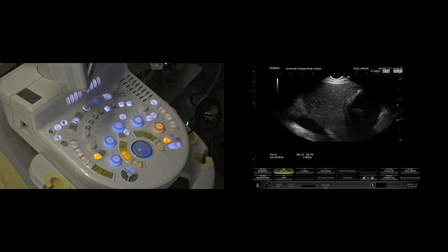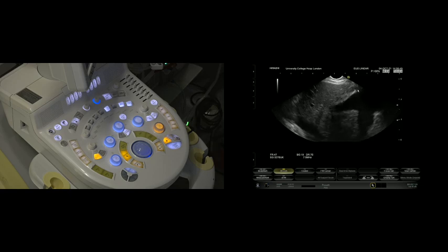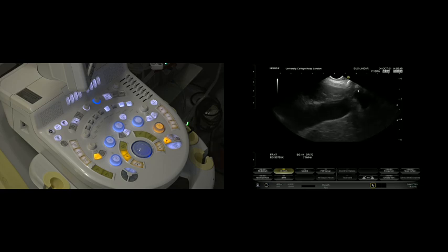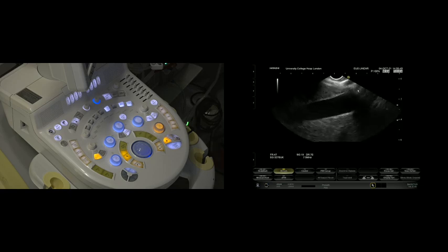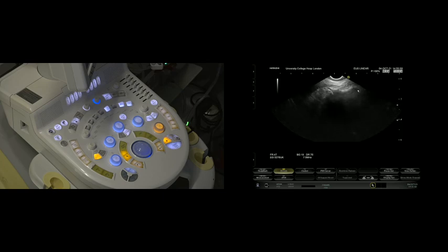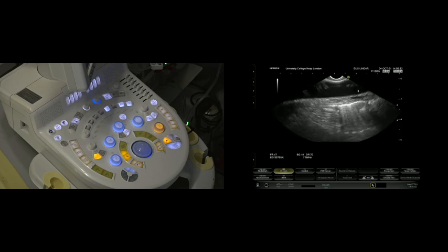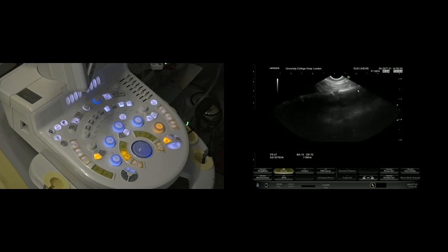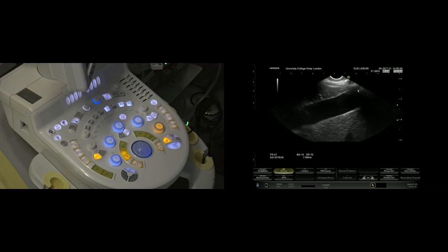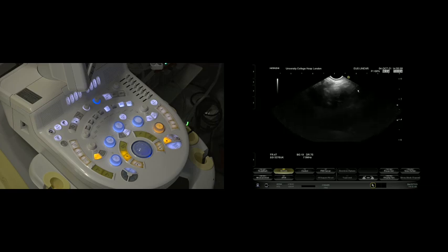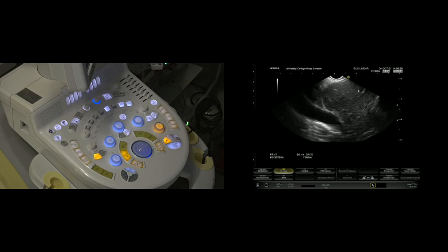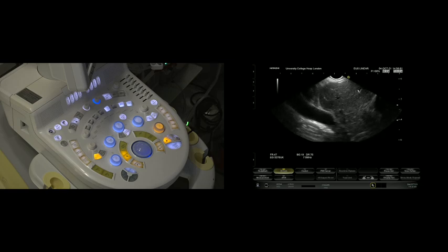If I shorten a little bit and do a little bit of torquing, you can see IVC and middle vein of the liver. That's the IVC running through the liver here. If I rotate clockwise from there, we're going to come in on aorta, which is there. But for the issues of what we call knobology, which probably needs a better name, it's all about the different features of the EUS console to enhance your image.